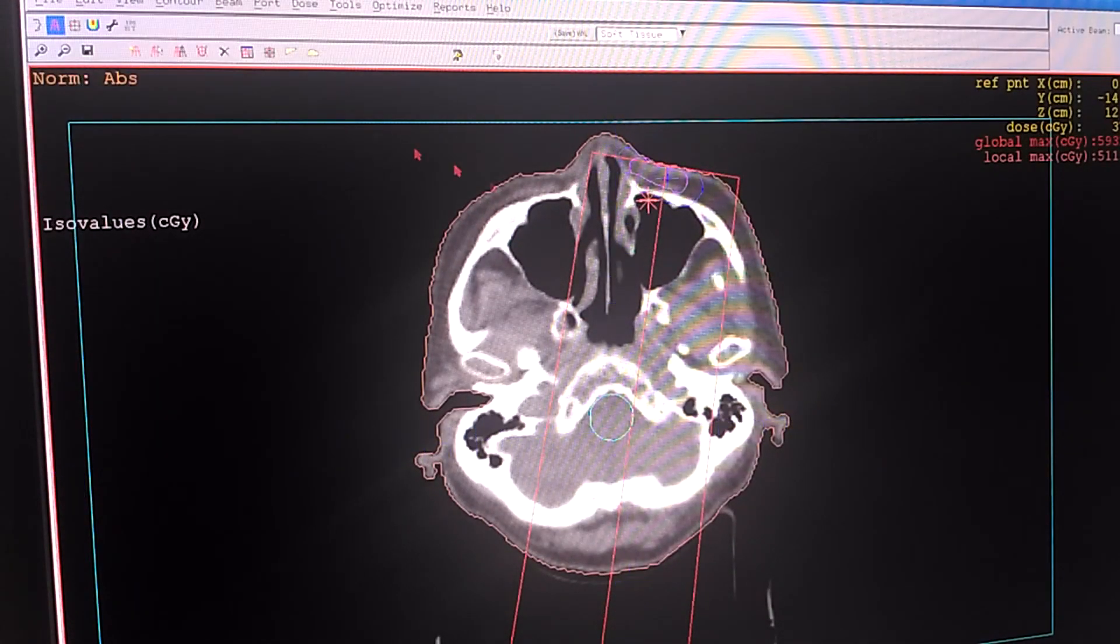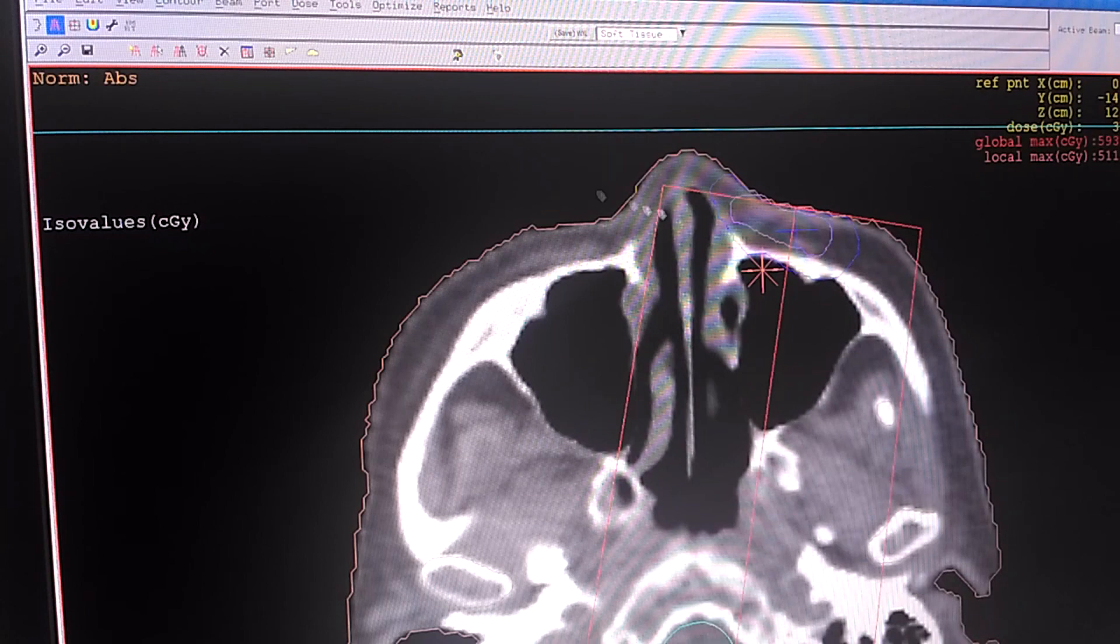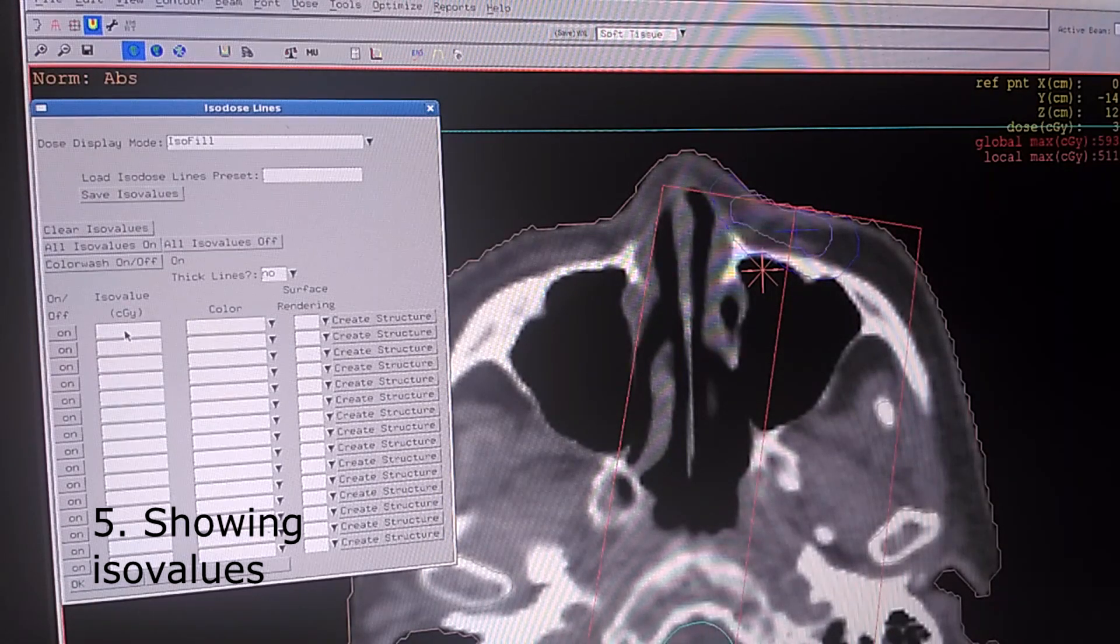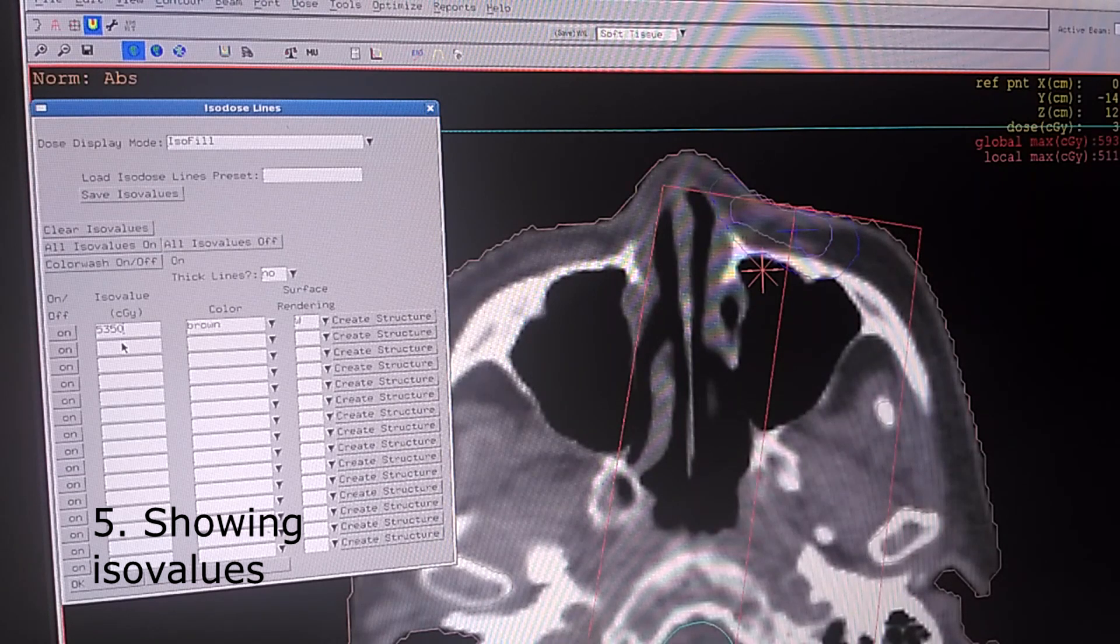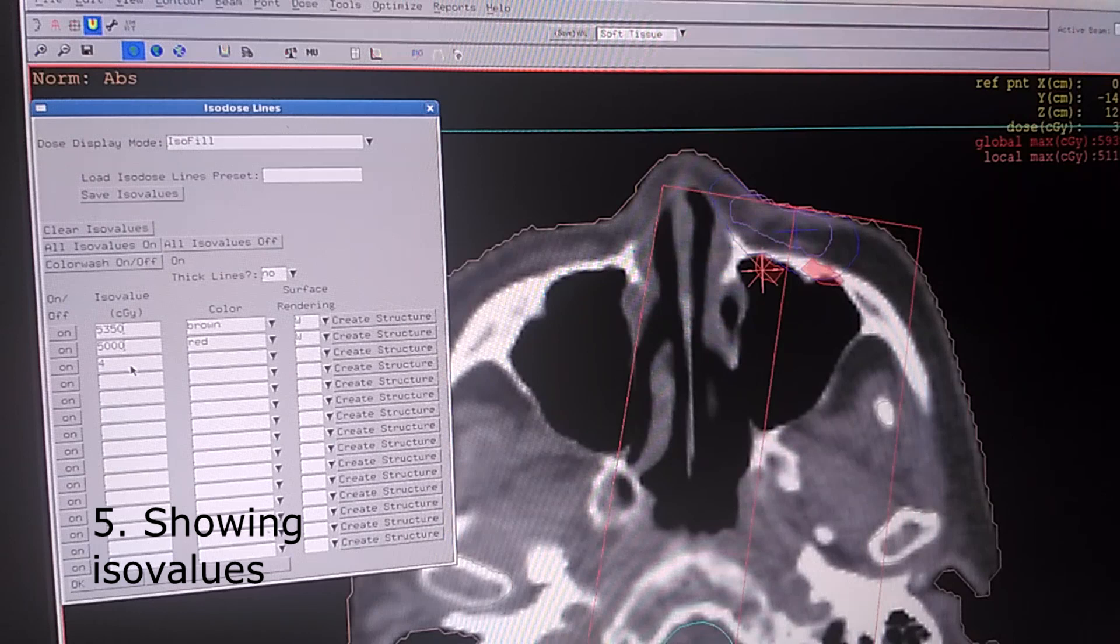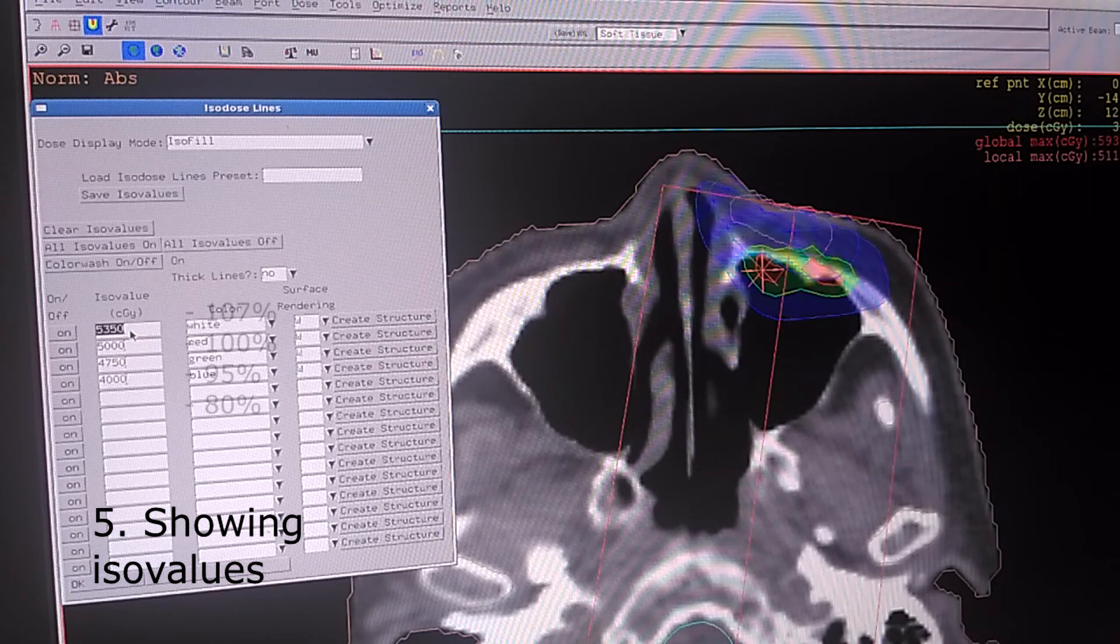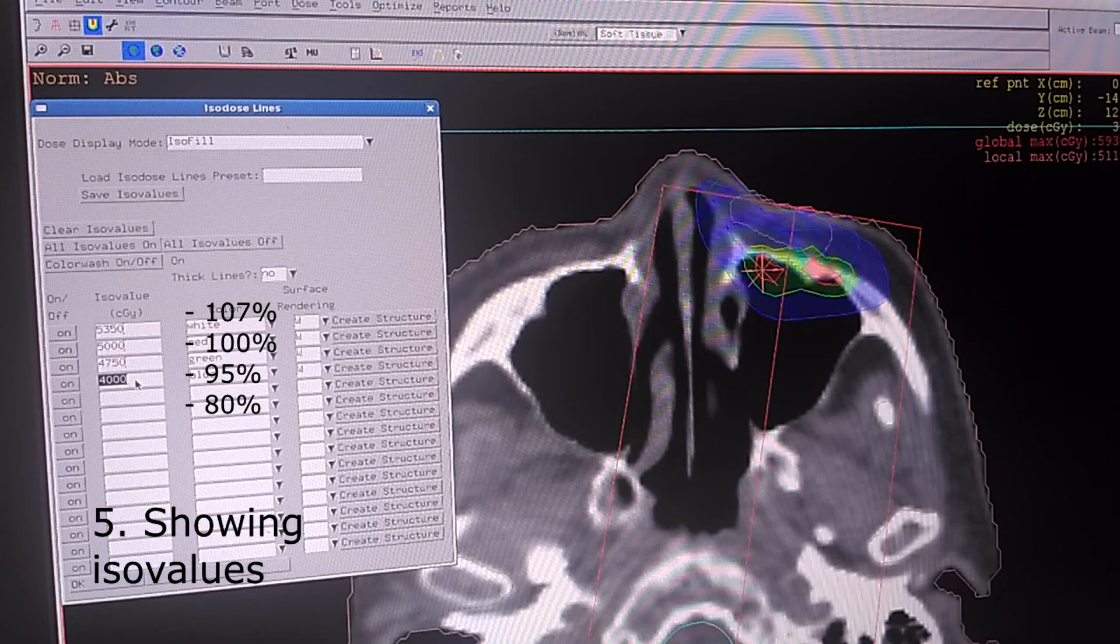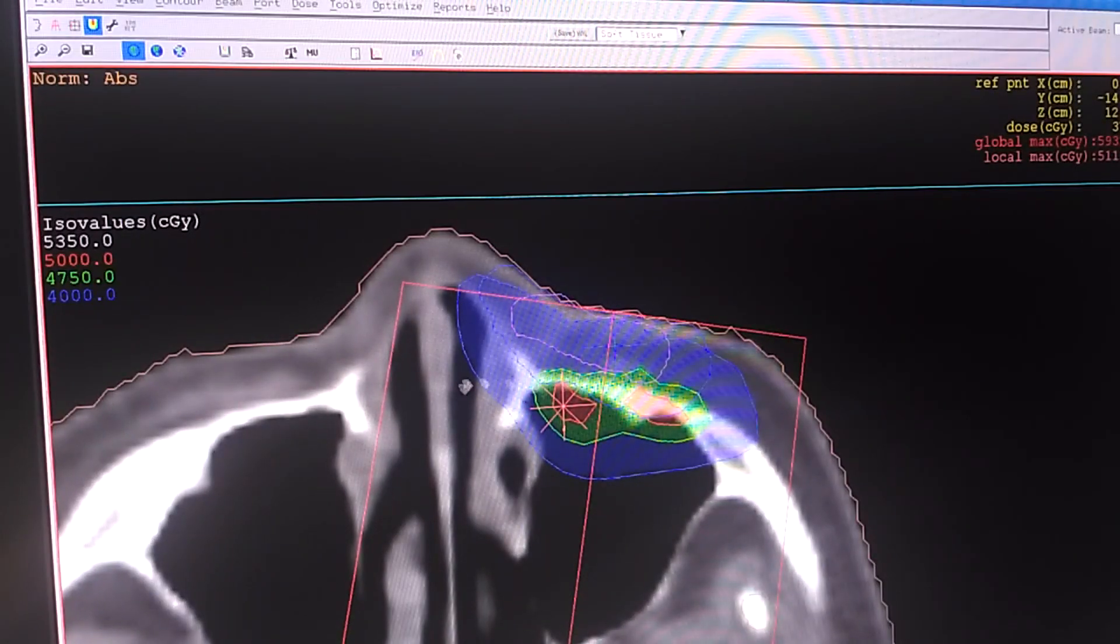Click OK. I'm going to turn off the scales. To see the dose we're going to activate it by using this one. I'm going to change it to isofill and put the dose which we like to see. This one is 107 percent, the 100 percent, the 95 percent and the 80 percent. We click OK and we can see the dose which is calculated here.